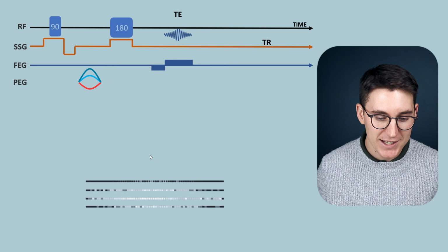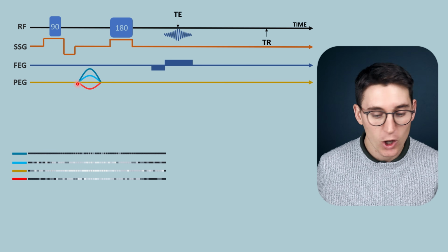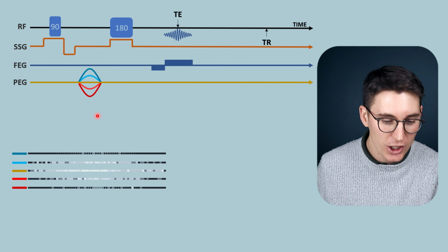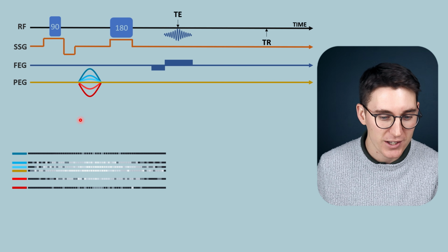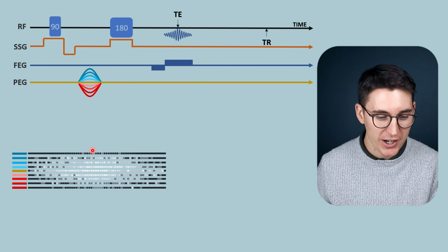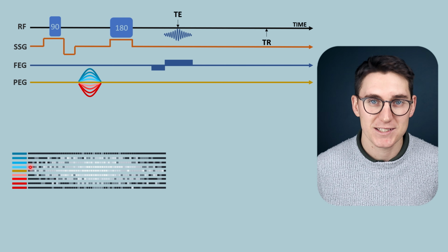Now, if we look at the data that we've acquired so far, we've used 4 different phase encoding steps. We can then use different magnitudes of phase encoding and apply that signal that we've acquired to a matrix here. And each time we use a different phase strength, we can generate a different signal here. And the way that we organize the signal that we're generating is based on the amount of phase that we use to acquire that signal.